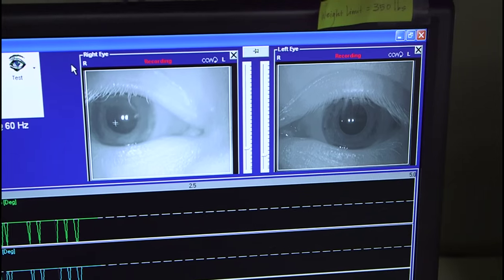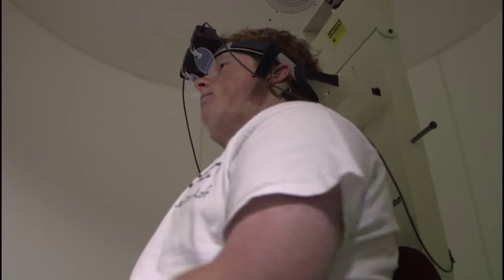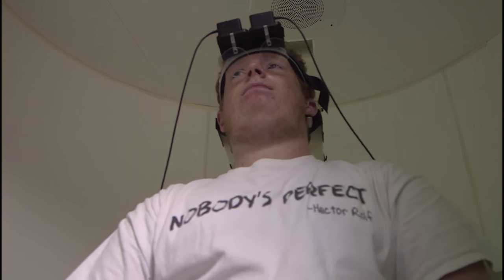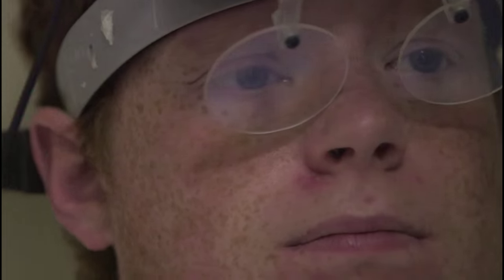Then it comes to a complete stop. The purpose of the test is to look at how well the balance center is working. This test is generally done for individuals who cannot have the caloric test done, who don't tolerate the caloric test, or for young children who are not going to lay still while we put water in their ears. The rotary chair test is a typical test of vestibular function for children aged six months and up.